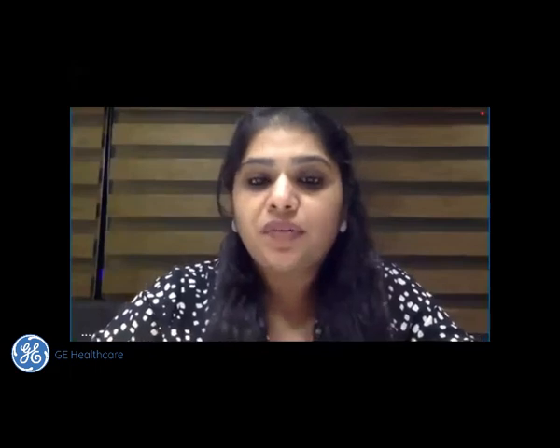Okay, Pooja, so first, when I saw them, a lot of them are actually asking how to date an IVF pregnancy. All our ultrasound machines as well as our software have various ways of entering the history, of which the commonest one we use is LMP. As soon as you enter the LMP, it gives you gestational age today and EDD. But in an IVF pregnancy, we do not rely on LMP. What we actually do is click on the LMP button and it will give you further subheadings, one of which is date of conception.